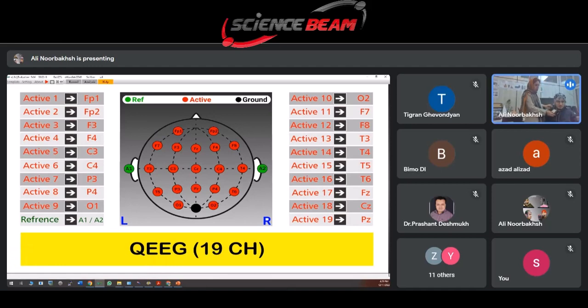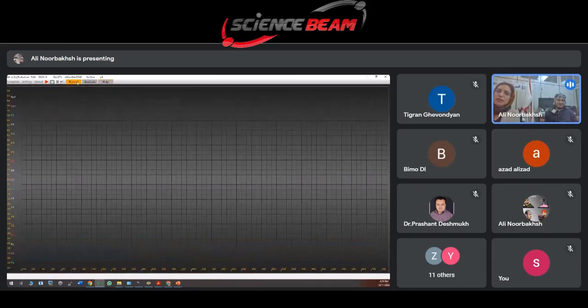And we should turn on the device. Now, I click on a record page and setting the device.